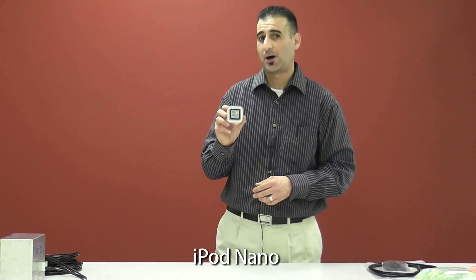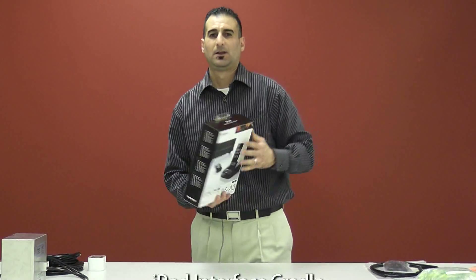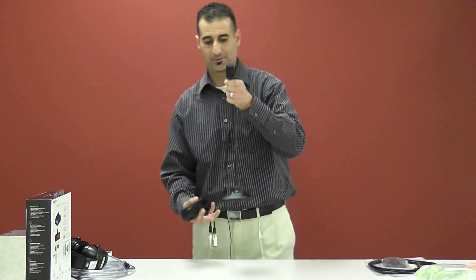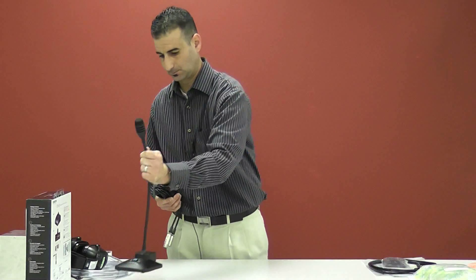Next we have our iPod Nano, which also comes with the sound system. You will also receive the cradle, which will house and charge the iPod Nano. Next we have our communication microphone, which has one push button for easy use, and it also comes with 20 feet of cable.